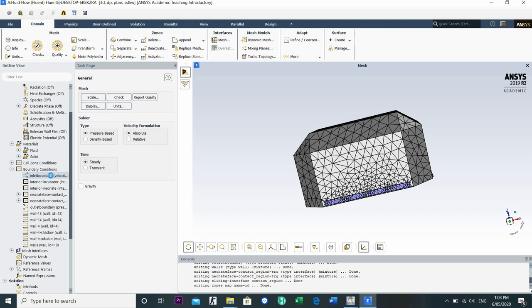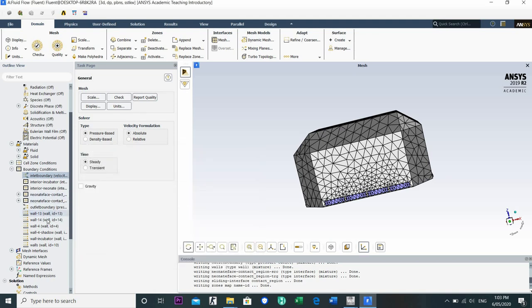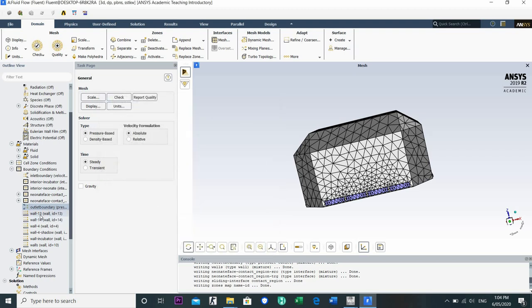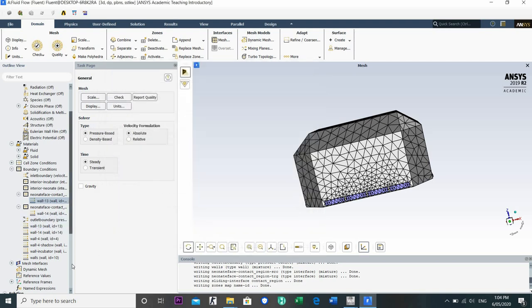Then the boundary condition, we are going to change this one to 0.45 meter per second. Okay, this is already right. The outlet boundary requires the backflow reference frame, gauge pressure. We don't need to set any other parameter. And for the walls, we just need to set a no-slip assumption, so actually there is no specific change.